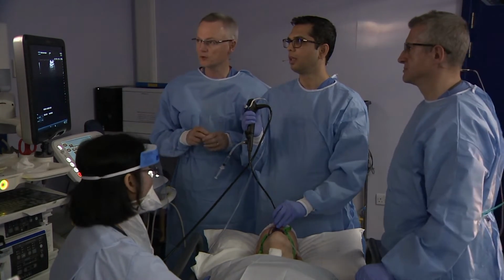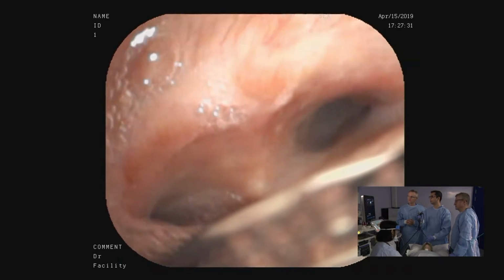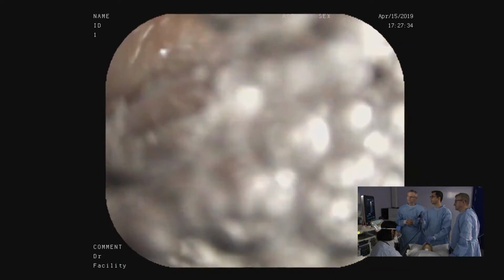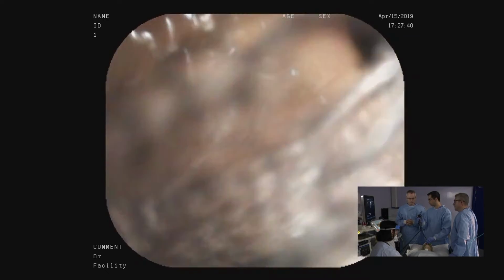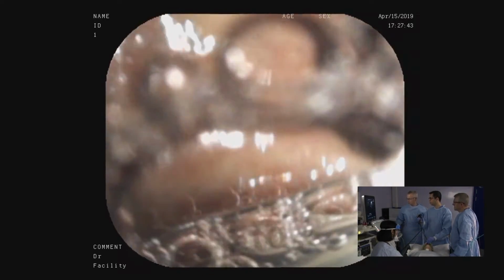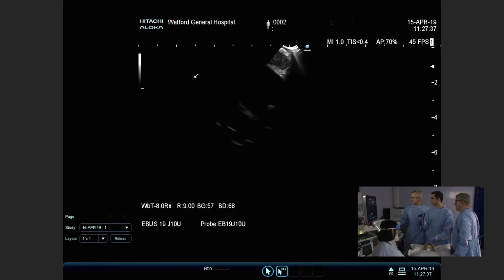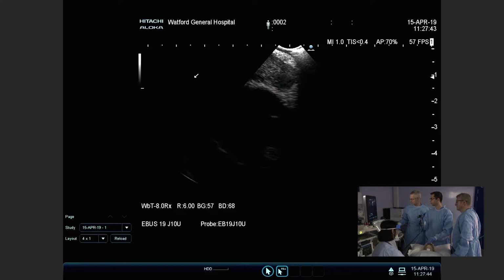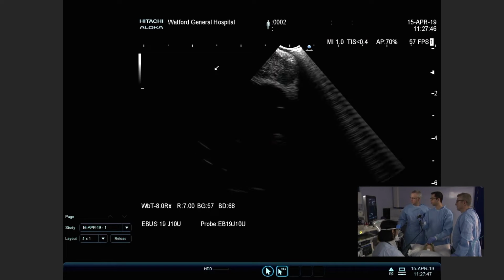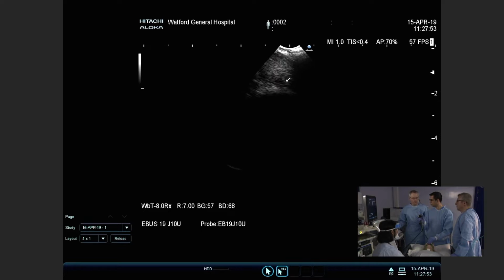Okay. So the next landmark is the subcarinal node from the left. That's probably one of the easiest to identify. You just go close to the carina and slide 1 or 2 cartilage interspaces below, and that is the subcarinal node there. Can we just have about a 5-6 centimeter depth of field? Yeah, 6 is fine. That's perfect. So you went down the left main bronchus there, or just on the tip of the left main bronchus? Yes, just sitting below the carina, literally just sitting below the carina.